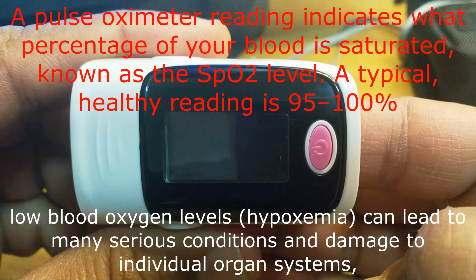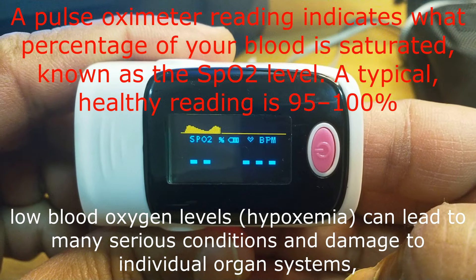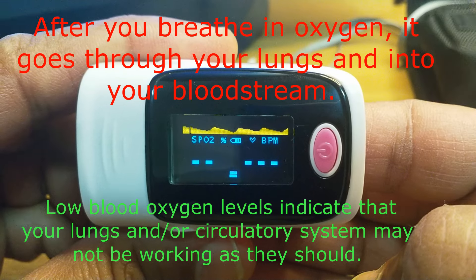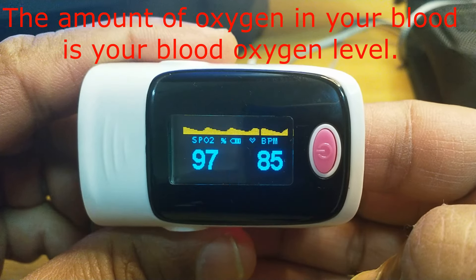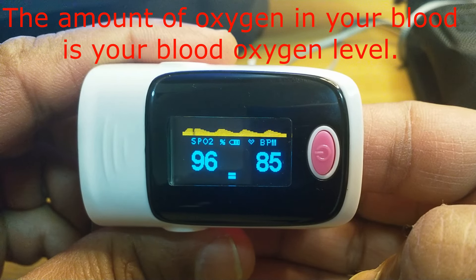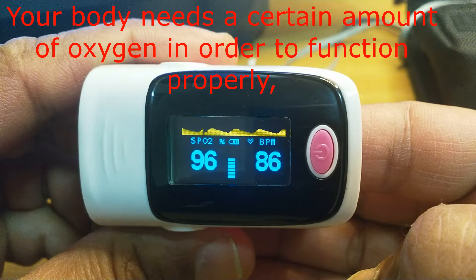Press this button and it is on. It is simply measuring — the first function is very easy, everybody knows how to check. Now it is measuring oxygen percentage: SpO2 is 96–97 percent, and the BPM pulse is 86.